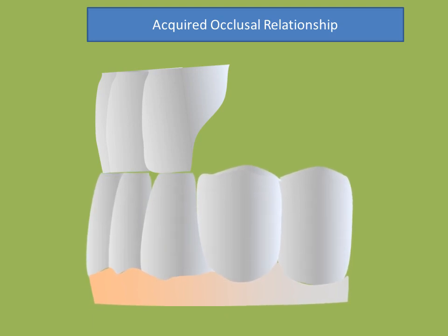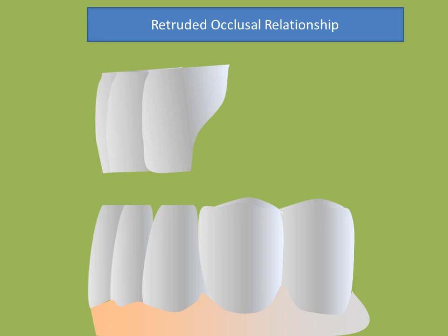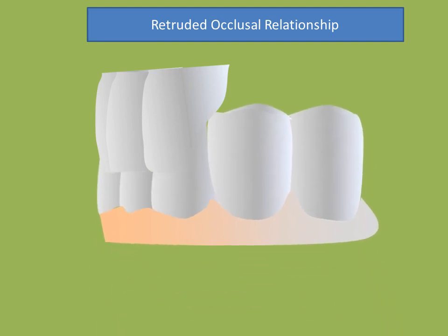Marie, it's important to examine the patient in the retruded position. The edge-to-edge relationship may simply be an acquired position due to the loss of posterior support. Right, you are, Dr. Goon. When asked to bite on her back teeth, the patient closes with contact very close to the palatal gingiva.